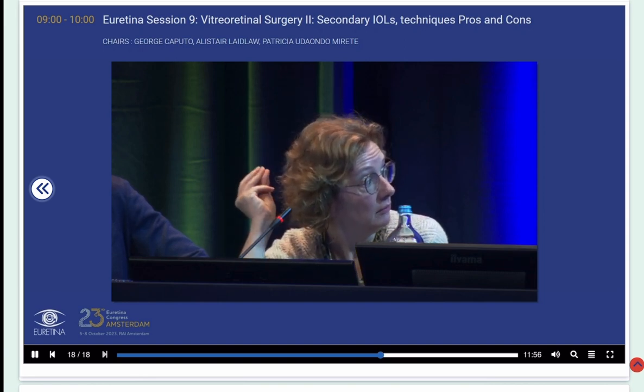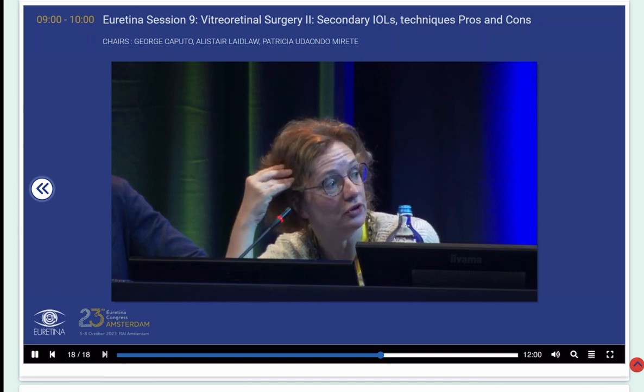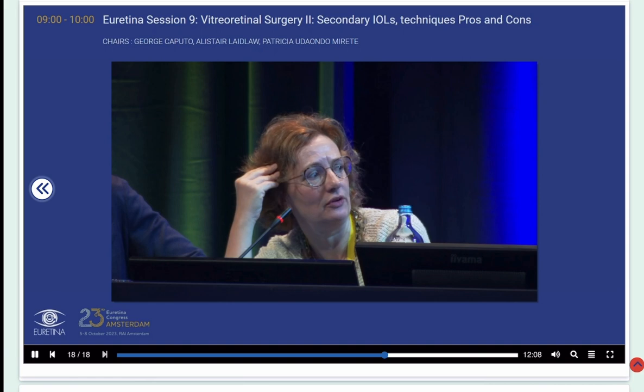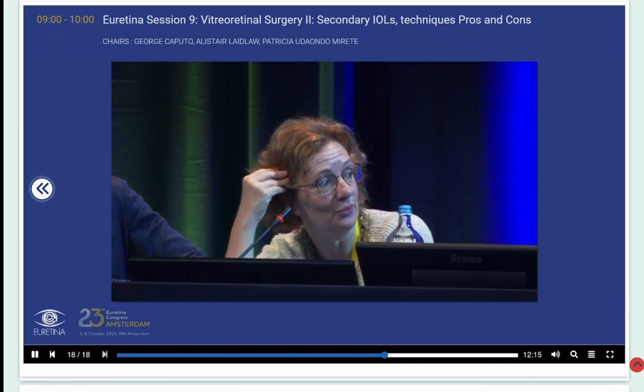Well, yeah, and that's why we got the Prolene suture breakages over time, didn't we? And it's like all these things. I think we've got to be really careful with these, because the time of follow-up we need to understand the long-term implications of what we're doing here is long, isn't it? It's not really 5 years, it's 15, 20, 25 years.